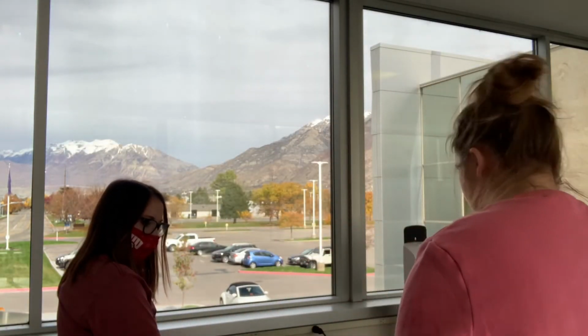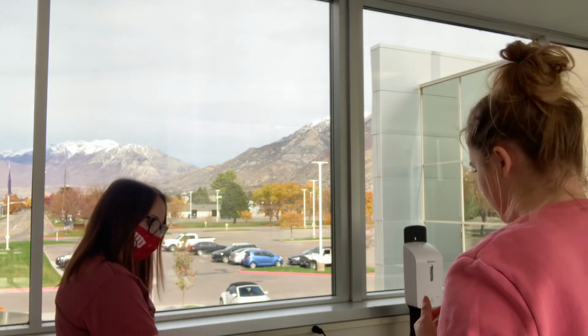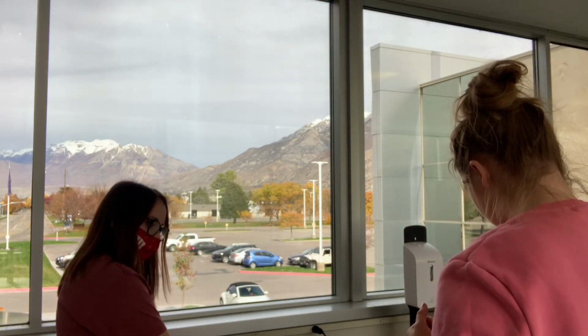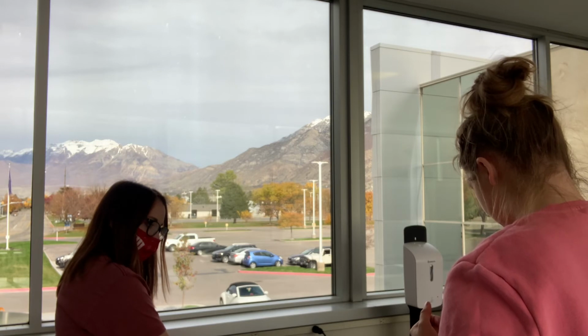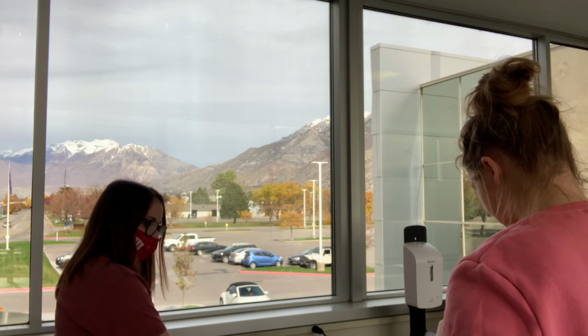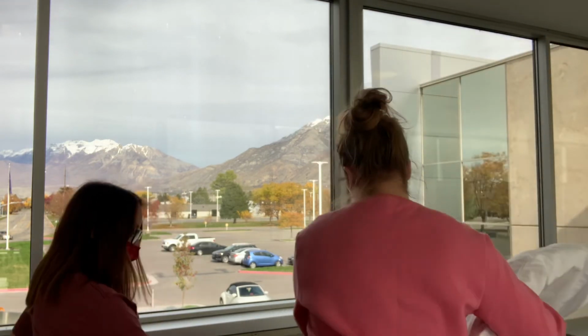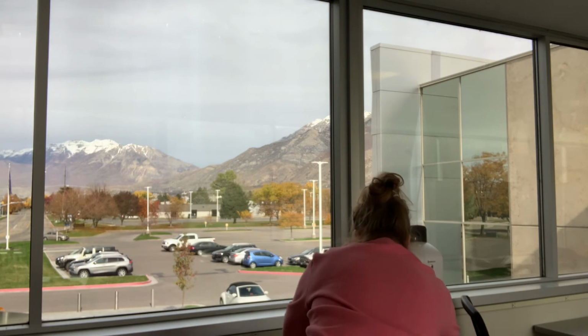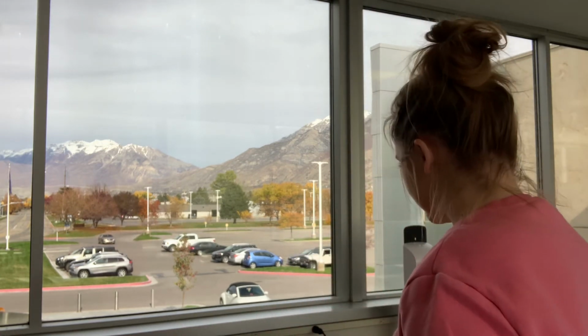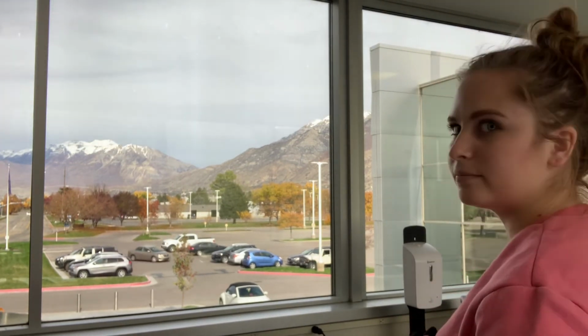Okay, Kayla, so just let me know when you feel a tingling or buzzing. It almost feels like TV static kind of in that knee, okay? Feeling anything like that yet? Just a little bit. Okay. Right there? Yeah. Okay, go ahead and lay down. We'll get this pillow up underneath your legs here. Are you comfortable like that? Yes. Okay, perfect. So we'll leave that on for 30 minutes and then we'll call it good.